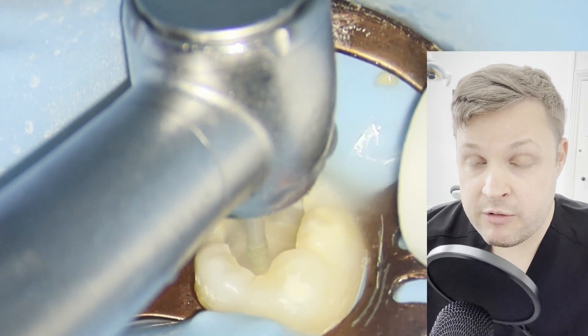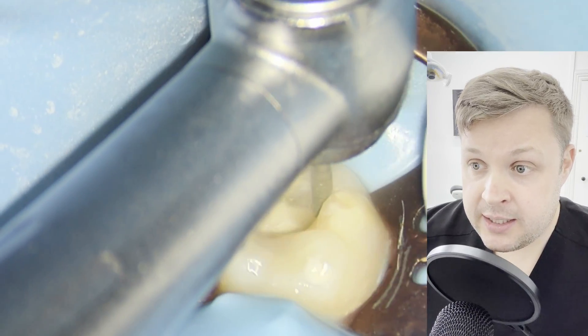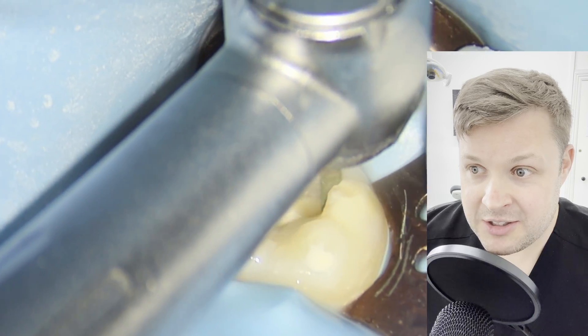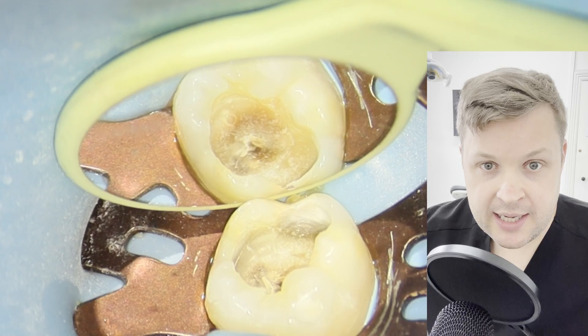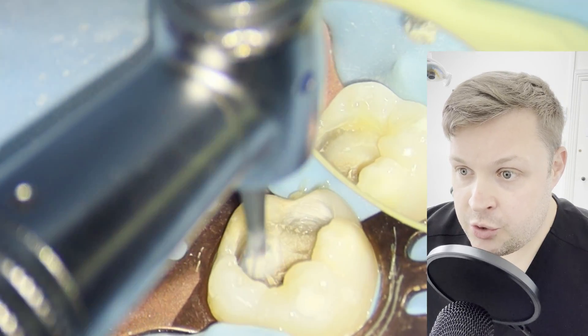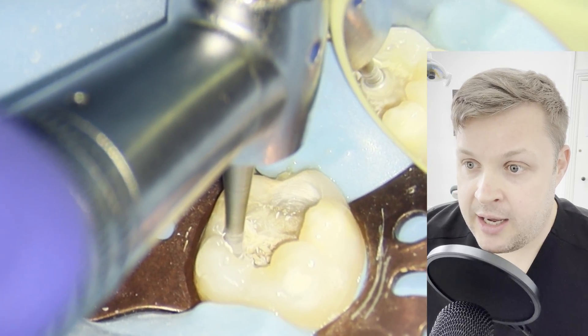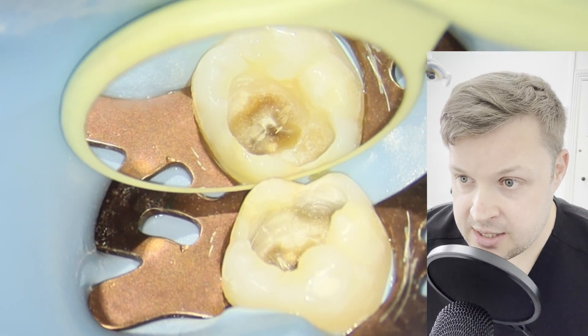Once I've removed the vast majority of the decay, I want to remove some of the undermined enamel around the edges of the cavity. This helps with the strength of the filling over time, and also helps to visualize where we are. I'm using the slow handpiece to gently remove the decay around the outer part of the cavity.